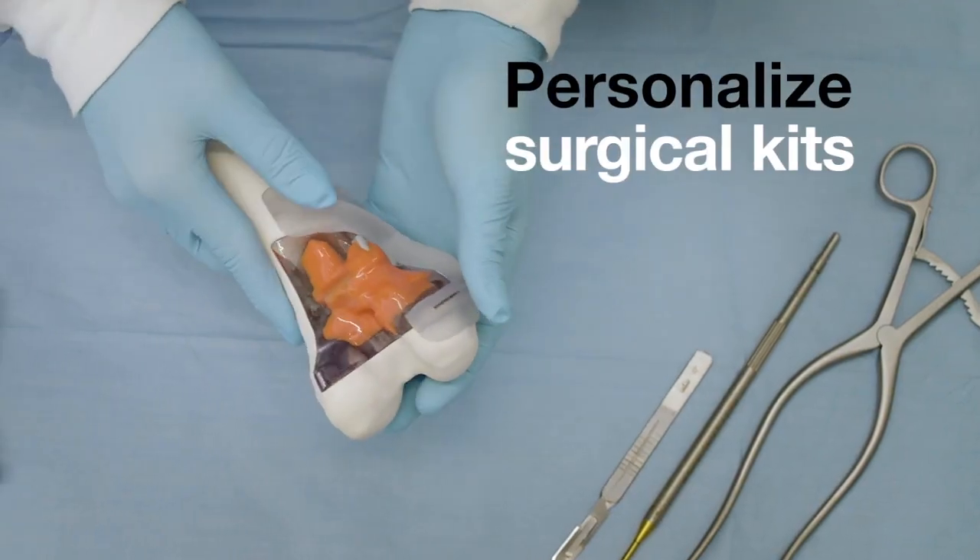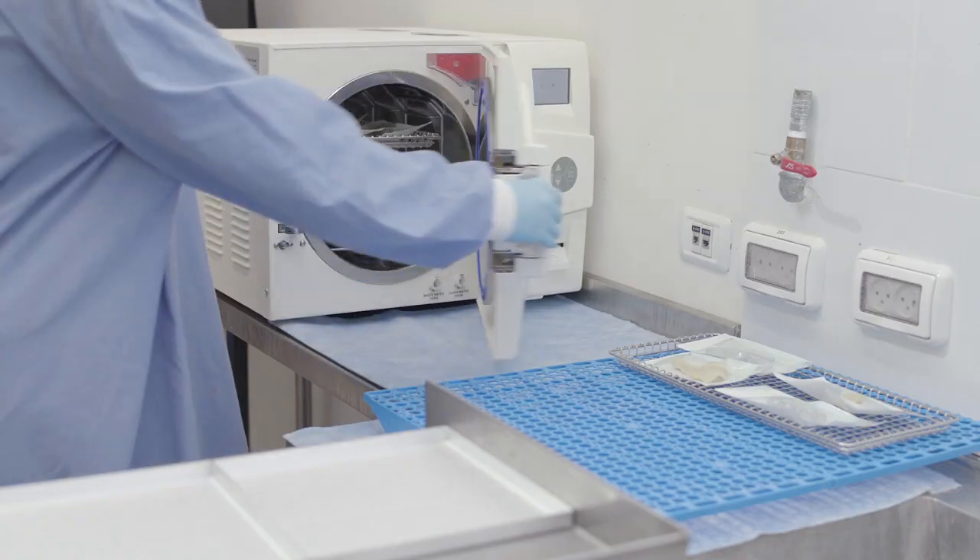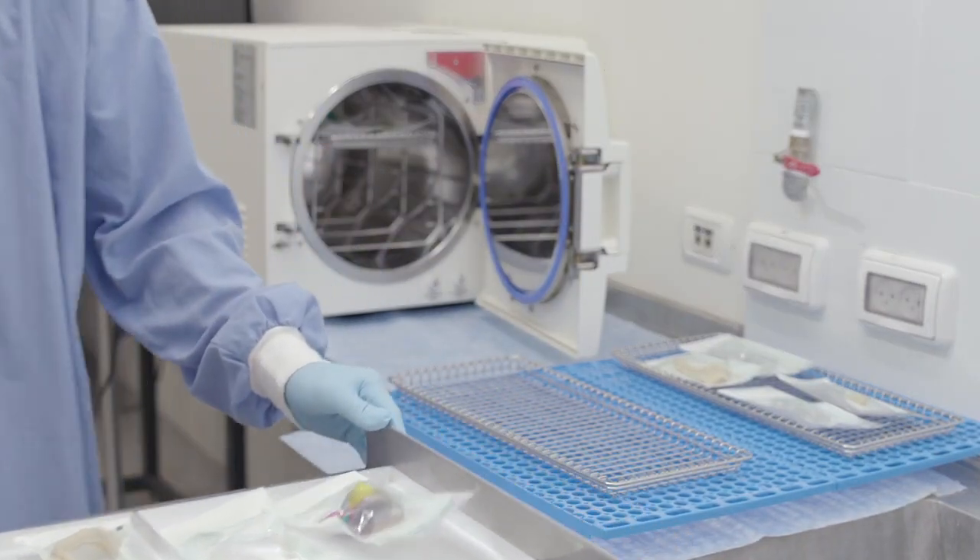Personalize surgical kits to patient anatomy with precision drilling and cutting guides, all made of strong, biocompatible, and sterilizable materials.